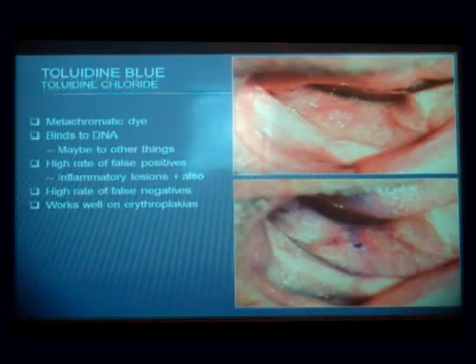And then you put this dye in, and then look at what you see and point out in your chart where the blue spots are, but you can't do that until you go through a minute of vinegar swishing again to get rid of any surface proteins. So they have to go through this vinegar business twice. And then if you see something positive, here we have a couple of blue spots. The idea is this is where we've got cells with large nuclei or lots of DNA, and they're close enough to the surface to be picked up by this stain. Maybe this doesn't happen if you have cells that are only bad at the bottom. I suspect that's the case.